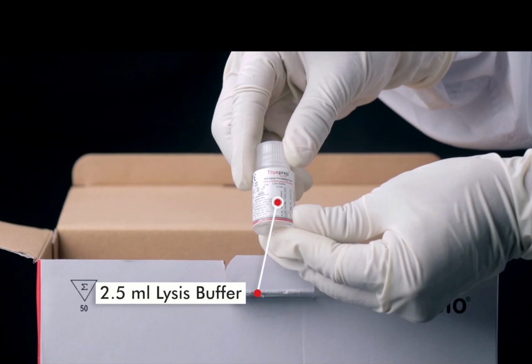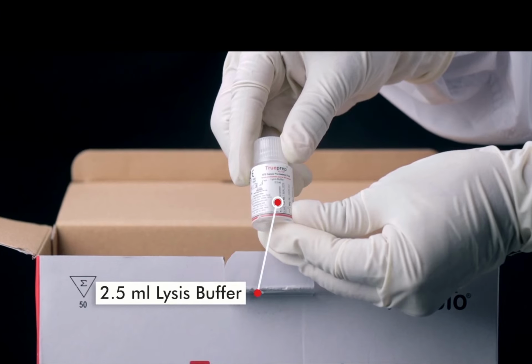So all the cells have to be broken because DNA is inside a cell, isn't it? So it has to be broken and the DNA has to come outside. That is the work which is done by lysis buffer. Okay, so this is how the sample is prepared.